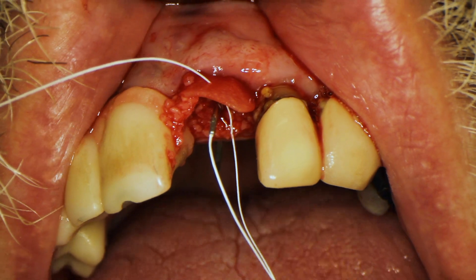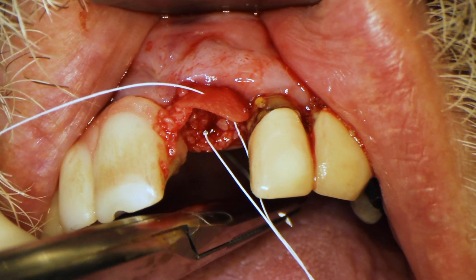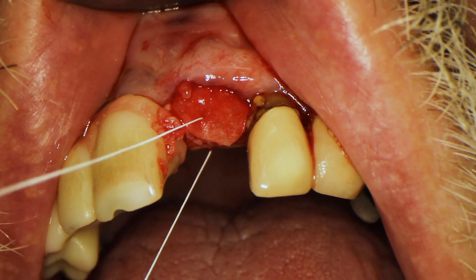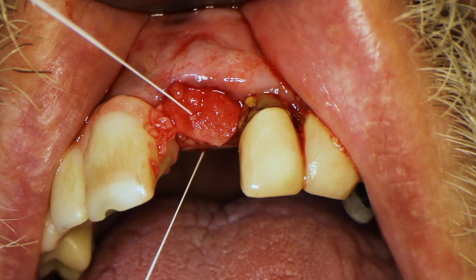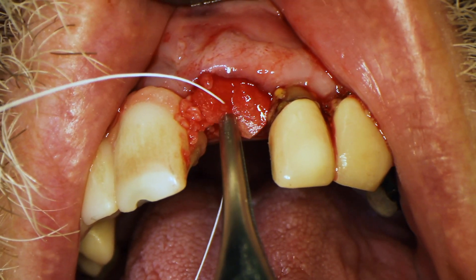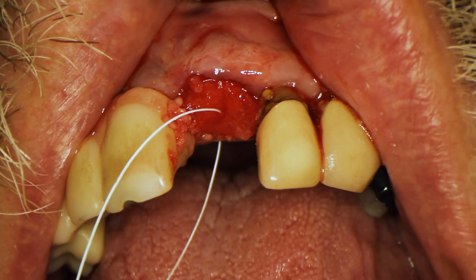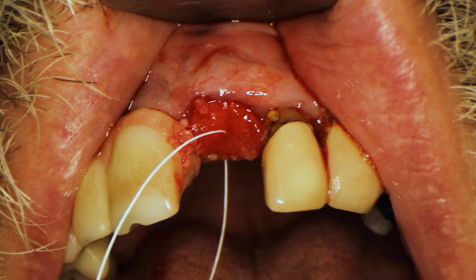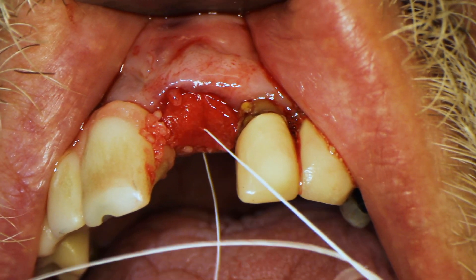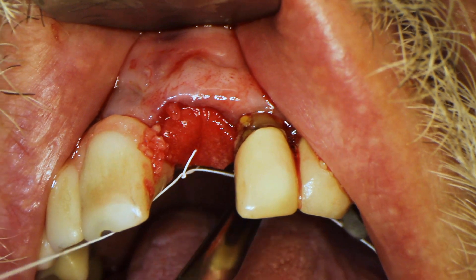Now I'm placing the suture through the lingual tissue, passing it through there. That pins down the side of the membrane that the suture is attached to. I'm using these Adson forceps to reposition the membrane to make sure it covers the entire socket. Then I place one interrupted knot here, pinning it to the lingual side.